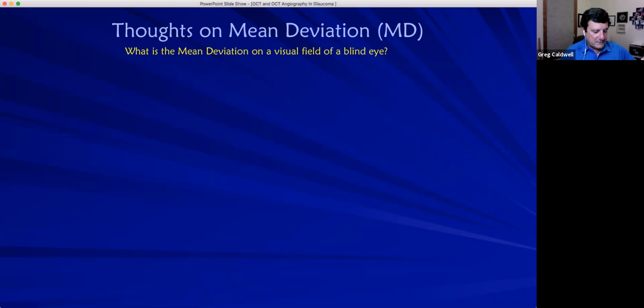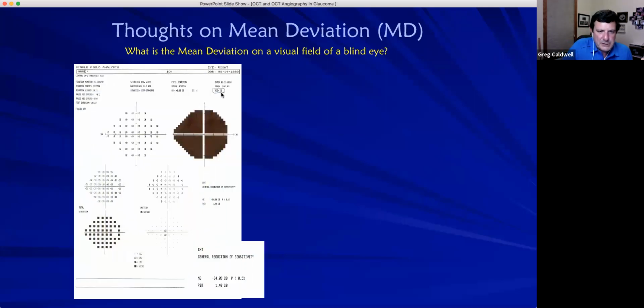I walked in, I was out there doing visual field interpretation. I walked in on a Monday after flying on a plane, being in a lecture, kind of pondering this stuff. And I said to my technician, "Hey, Sarah, do me a favor. Walk into the room, plug into the visual field, plug in age 30 or 35, whatever's listed here. Let the visual field run as if they're a blind eye. They would never hit it." And she looked at me and said, "Hey, doc, you really have a bad weekend? What's going on?" I said, no, I just need to know this.